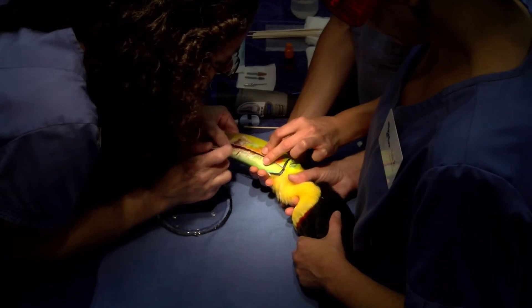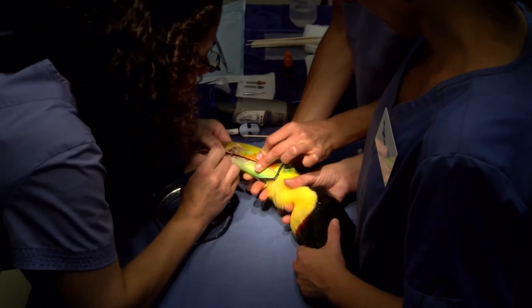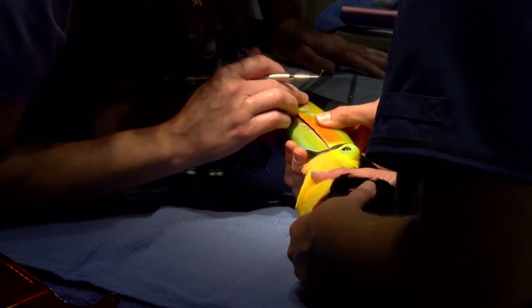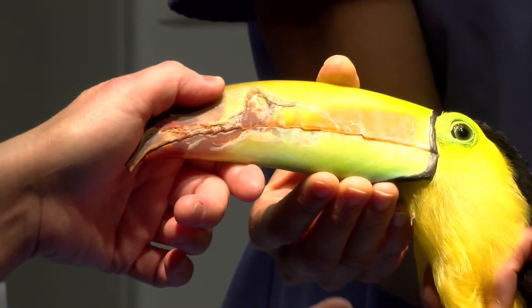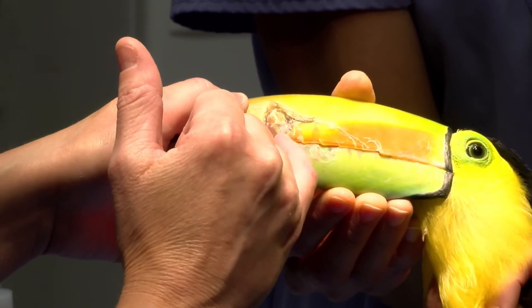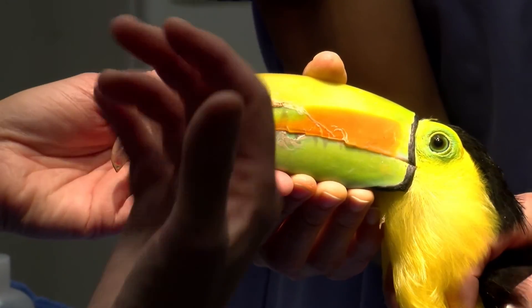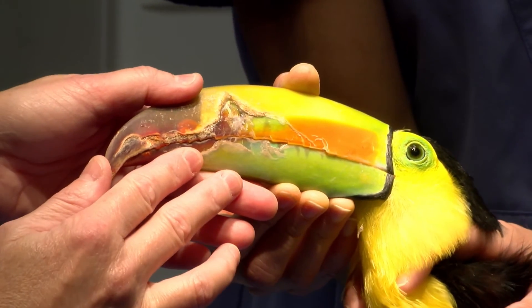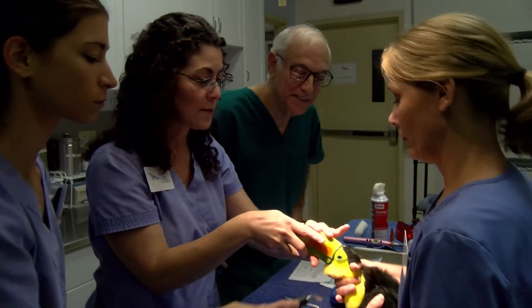I'm going to open his bill just a little bit — get in here. A toucan's bill is highly layered; it's a bunch of compressed, thin layers of keratin. So when it breaks, it all flakes off and cracks, and that's why a toucan's bill can actually completely come off. What we did today was secure and bridge the biggest crack, so it's now solid and we don't risk more layers coming off and more cracks occurring that would render him without a bill.